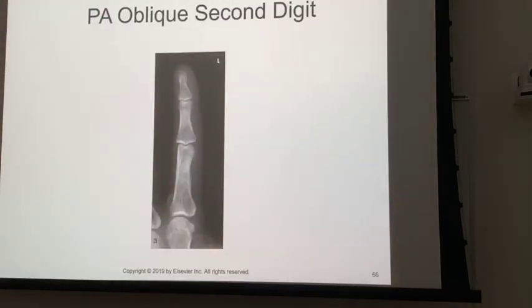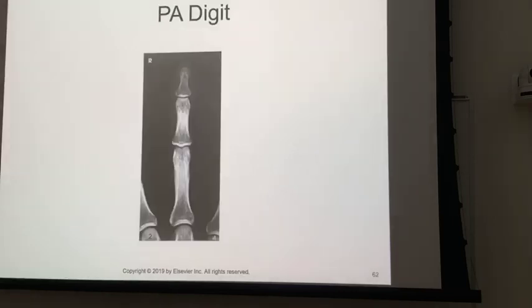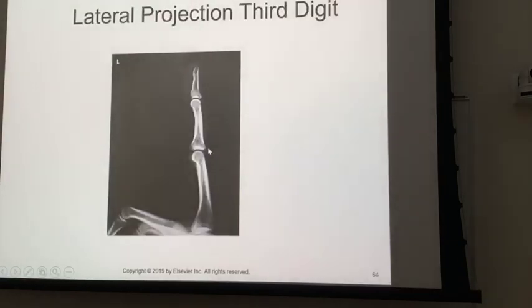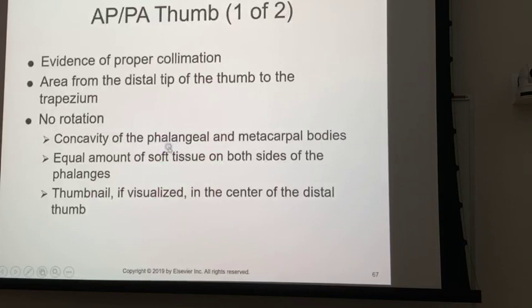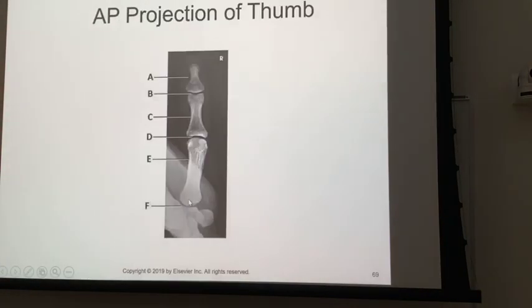That's just an ugly image, but it's oblique, and what you see is the posterior side becomes pretty flat, as opposed to the AP. You see on the AP, it's kind of hourglass shaped. On the oblique, you lose that hourglass shape on one side, and it increases on the opposite. So it gets really pretty flat on the posterior side, and the concavity increases on the anterior side.